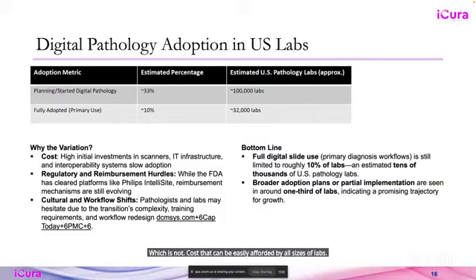Secondly, especially in a clinical diagnostic lab, everything you use needs to be FDA approved. If not, you're going to have to go through a very complex so-called validation to make a lab developed test, called an LDT. Again, not every lab has the capacity to do that.